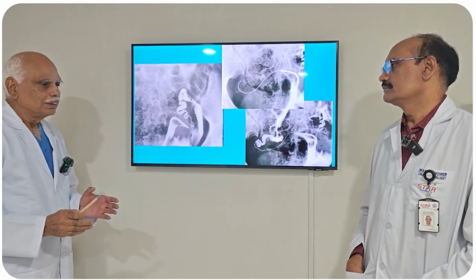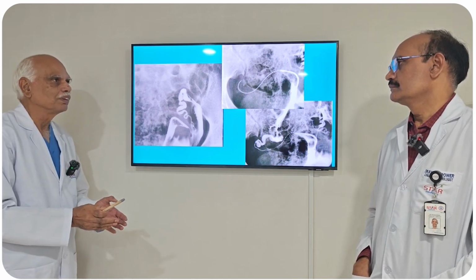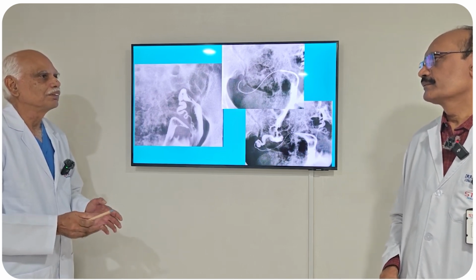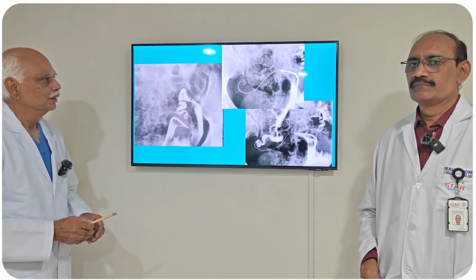So this is a procedure. It should be done at the same time as the hysterosalpingogram, and if there is a tubal block, you open it up. So that is the advantage of this procedure. Next.